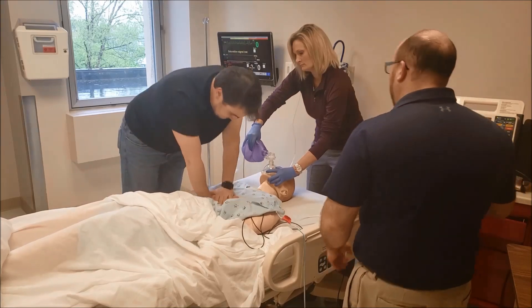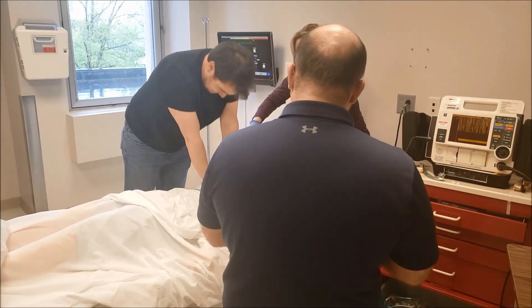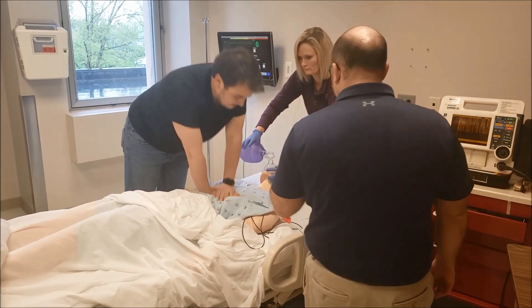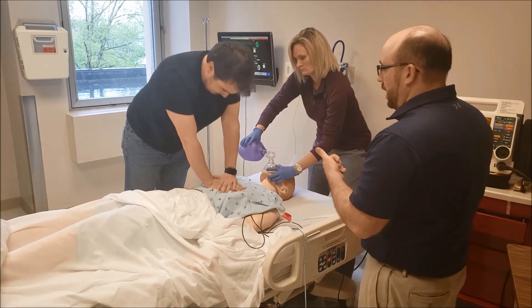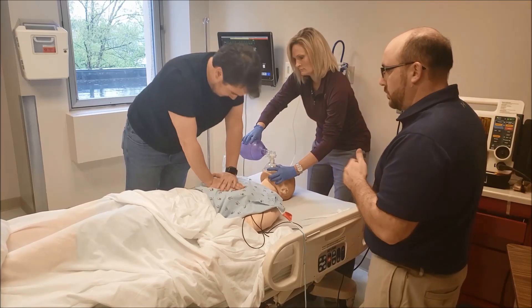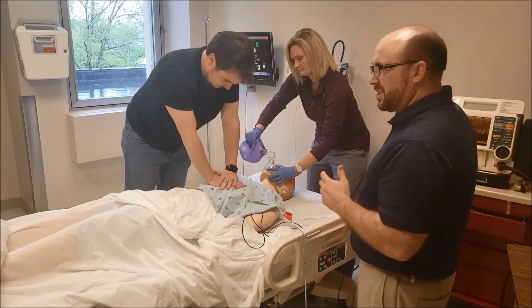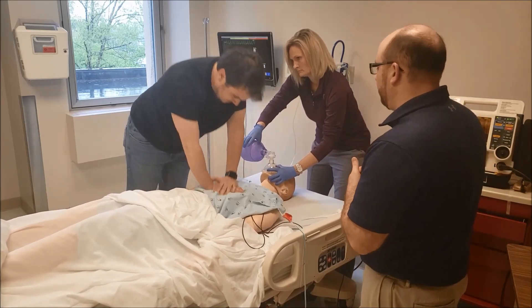Continue CPR. During this time I'm going to think about my H's and T's — things that may have caused this. Starting with our H's: hydrogen ion — we'll get a blood gas. Also hypoxia. Hyper- and hypokalemia — those are all part of a blood gas. We should get a blood gas. Hypothermia — we can try to get a temperature, though I don't really think that's what this gentleman came in with.